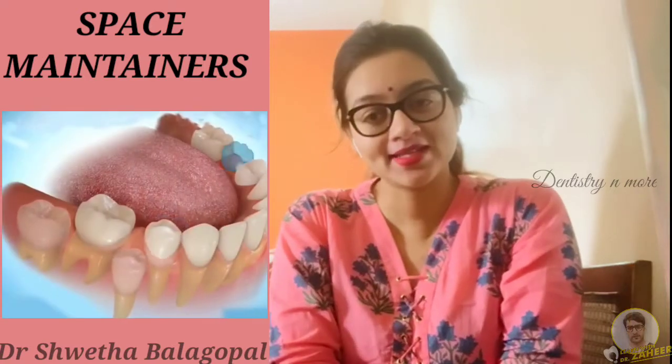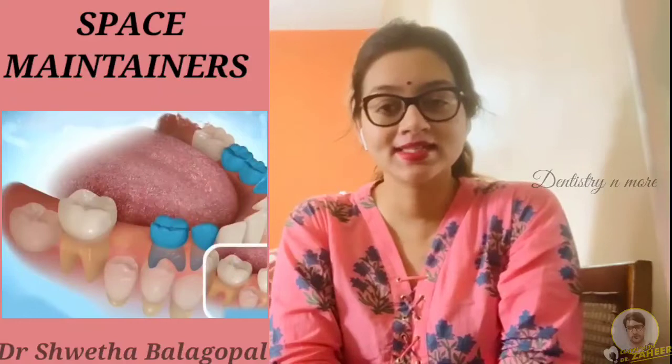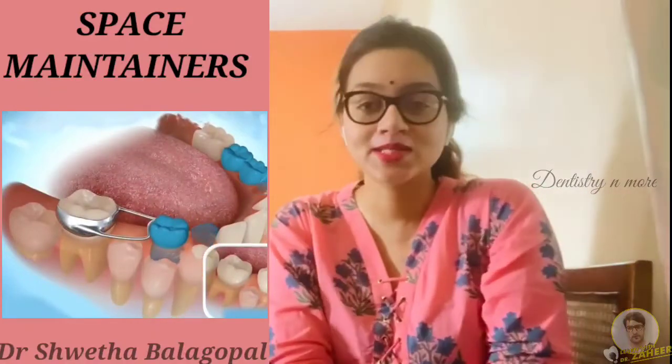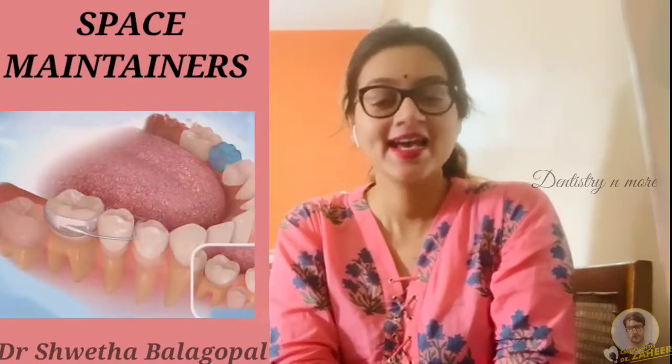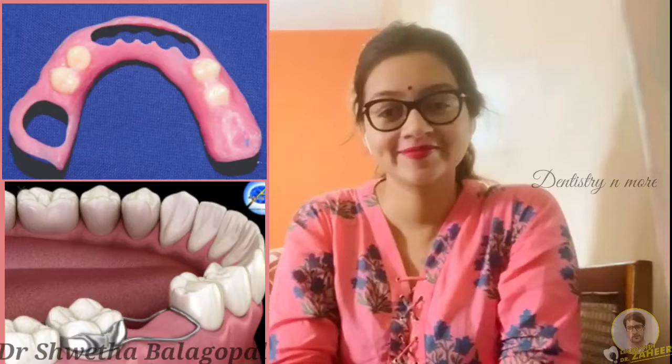What is a space maintainer? Space maintainers are appliances that are used to maintain space or regain minor amounts of space lost so as to guide the unerupted tooth into proper position. There are two types of space maintainers, removable and fixed.